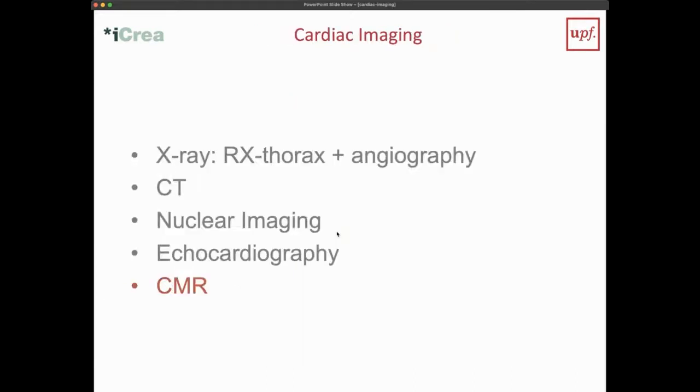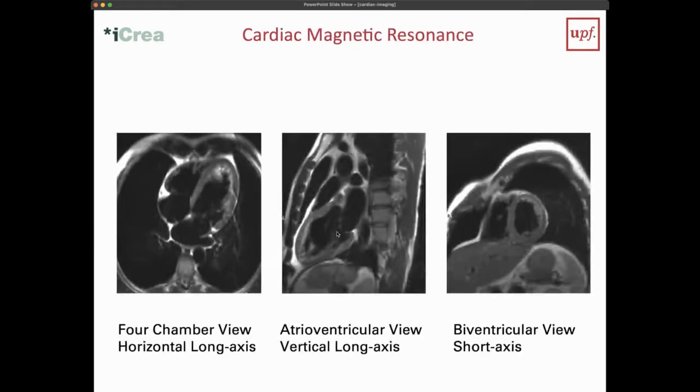Okay. So as the last imaging modality, we obviously have MRI imaging. And with MRI imaging, because we can look at soft tissue so well, we can make really nice images of the heart. So you can really see the full anatomy. You can see the full anatomy in 3D, which is a big advantage.